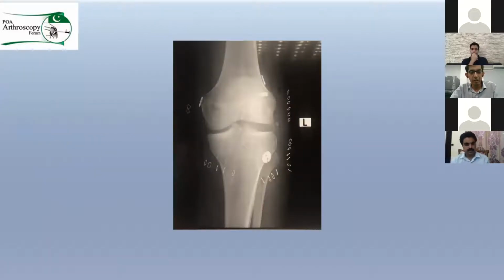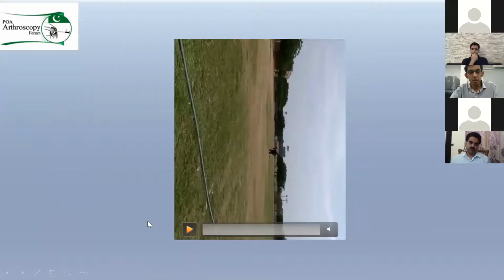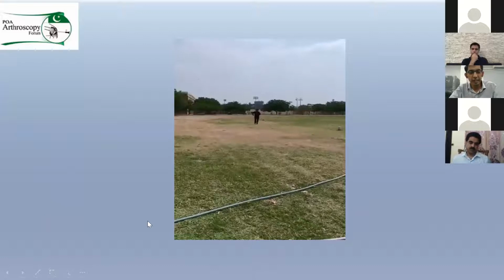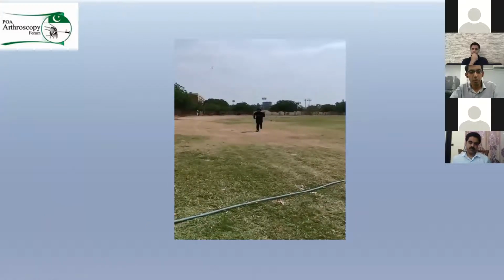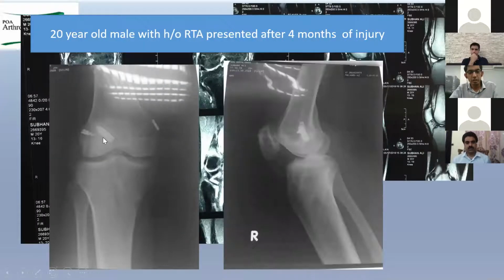These are the post-op x-rays, and you can see the fixations are good. And this is the 9-month postoperative follow-up of this patient. The patient is able to go back to his activities and sports, and this is approximately 1.5 years down the line. Another patient with PLC injuries, we used the graft because the tendons were not thick enough.